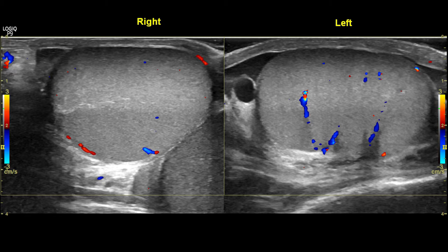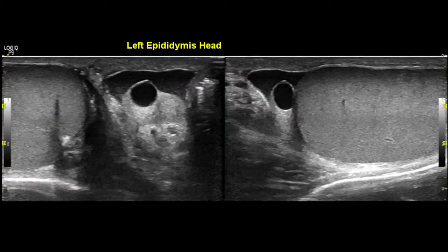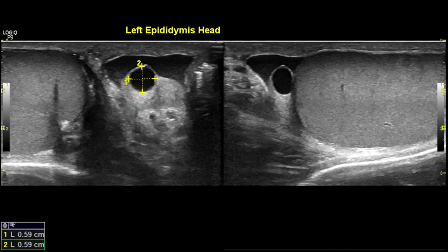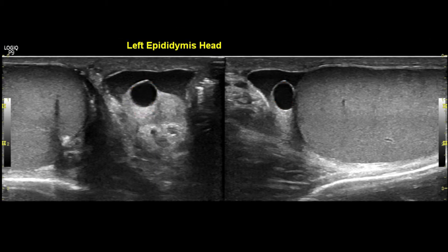Here you can see both testes. An anechoic structure is noted at the left epididymal head. Here you can see the left epididymal head and the cystic area. Adjacent to the cystic area, some collection is also seen.